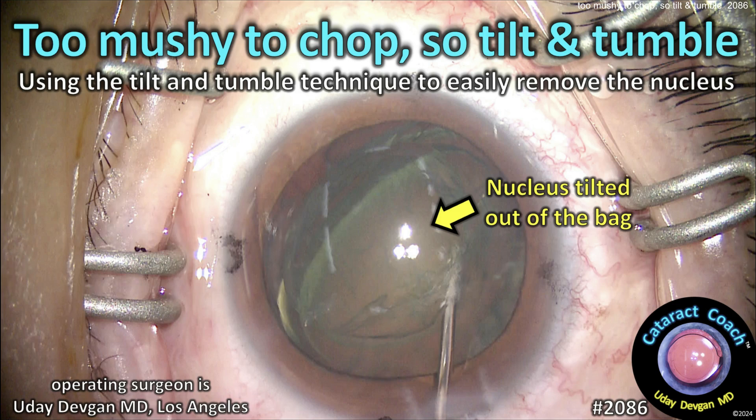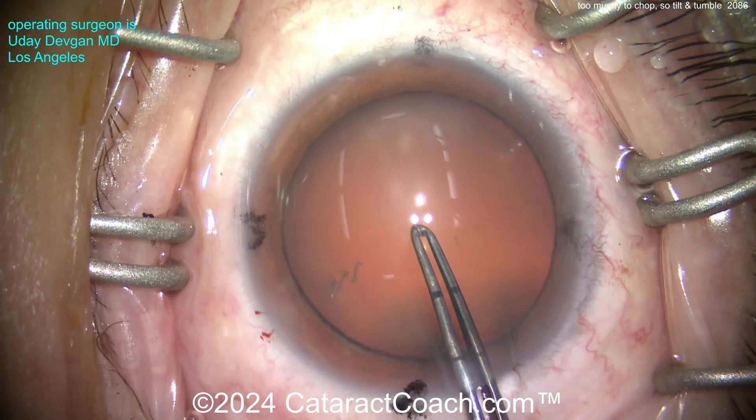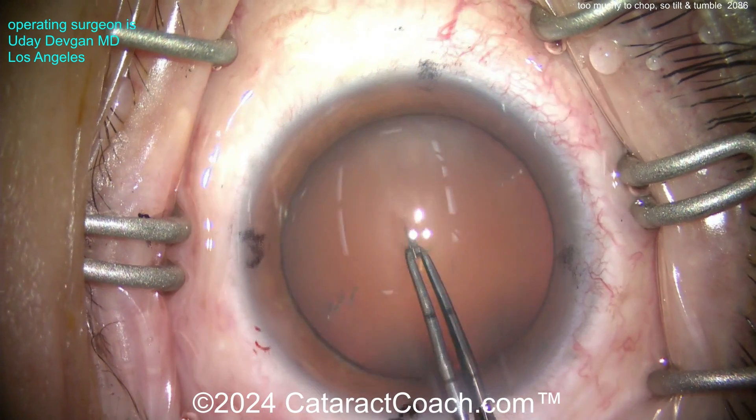cataractcoach.com. Too mushy to chop, so let's do tilt and tumble. Using this technique we can easily remove this relatively soft nucleus. Here's our patient - nicely dilated, really mild cataract, definitely a Beverly Hills cataract.